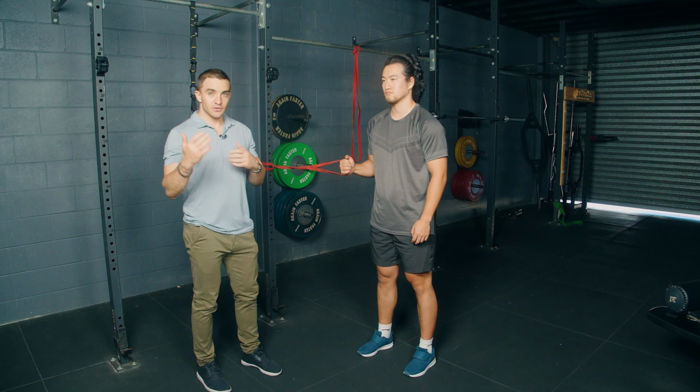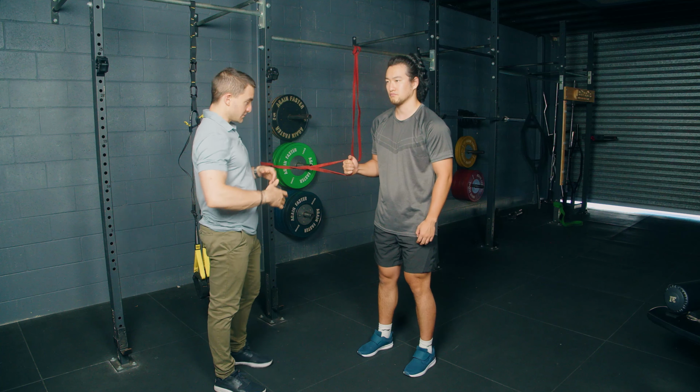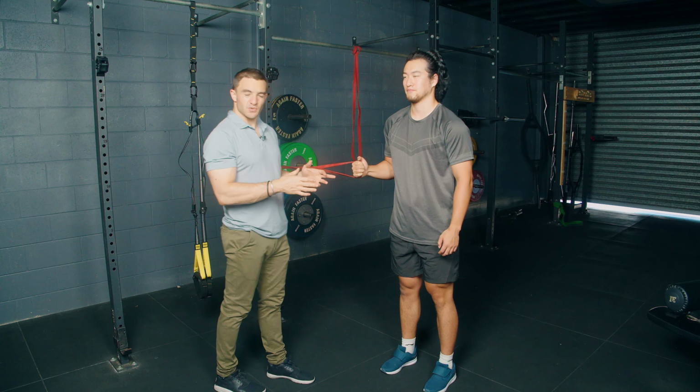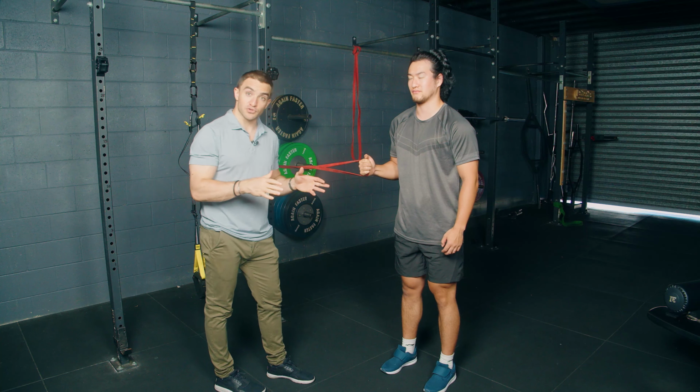Hold, again, 10, 20, 30 seconds, whatever's appropriate for your specific protocol, and then relax off. So Cal, holding that position, go ahead and pop out. Good. If that is the place where he feels like he can hold a resistance, but he's about to give up, we'll hold there for a certain prescribed amount of time.